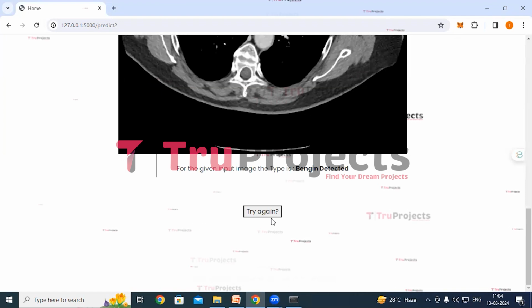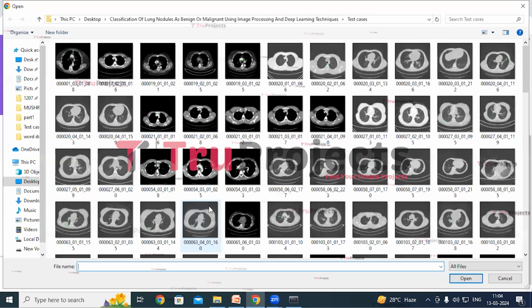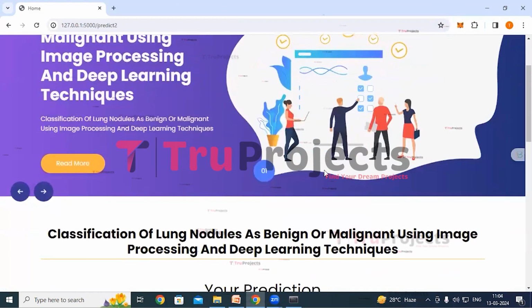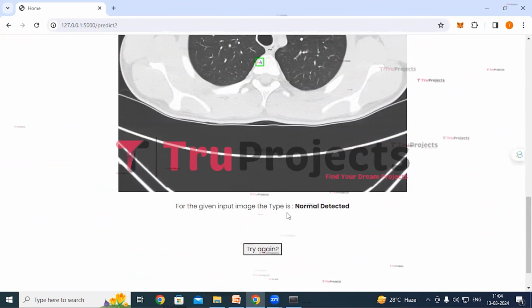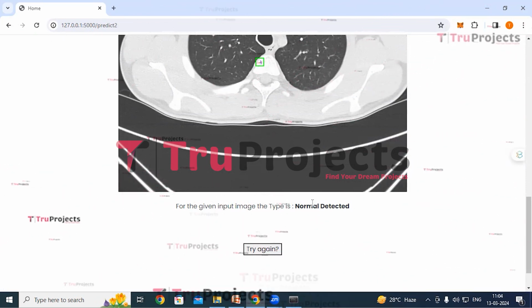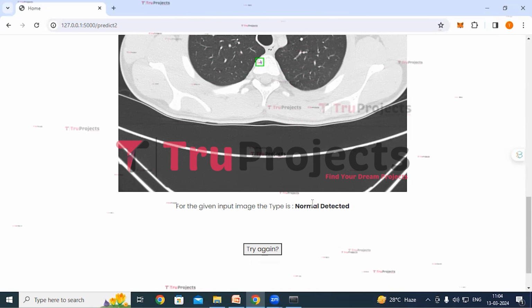So we'll try again. Click on try again link. Click on choose file button. So this time I'm selecting this image and click on open. The image is loaded. Now click on upload button. This is the uploaded radiological image, and here we can see the classification that is normal. So normal indicates that the lung nodule is not cancerous and it will not harm health.